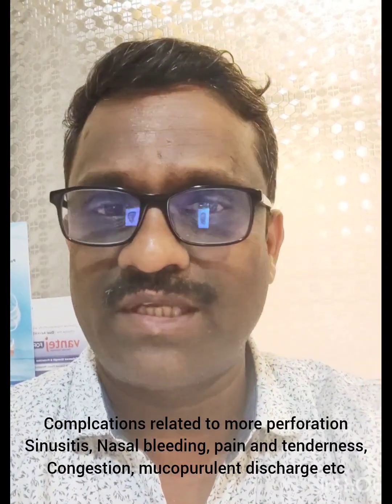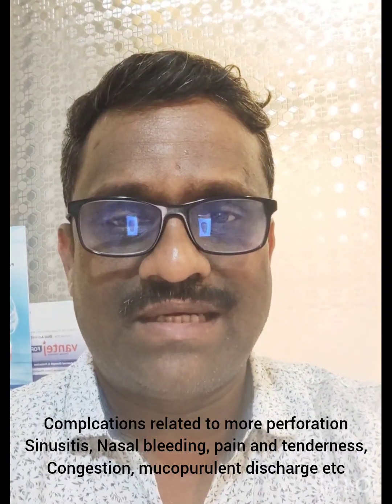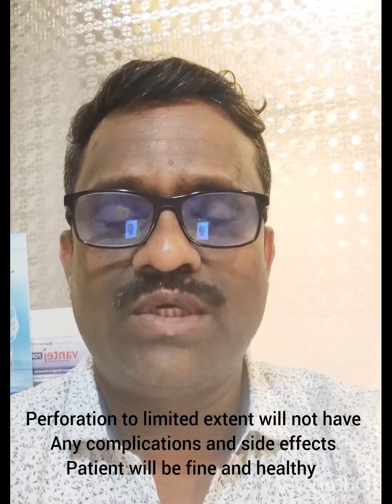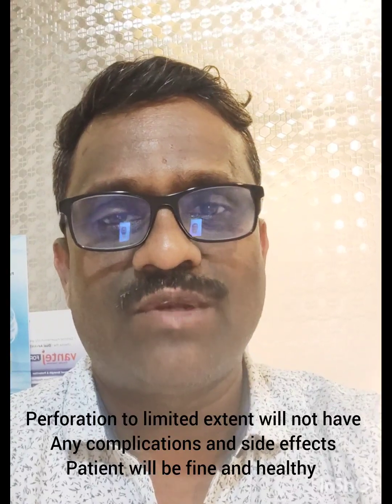All the patients are fine, no post-operative complications, no infections inside the maxillary sinus, no sinusitis, no polyp or mucosal or granuloma tissue formation. So no side effects are there. So most of the time nothing is going to happen, and the implant success rate also will be good.